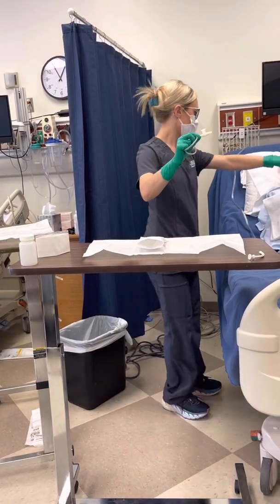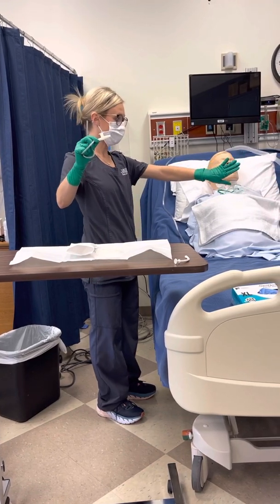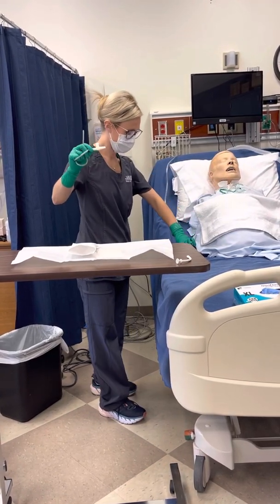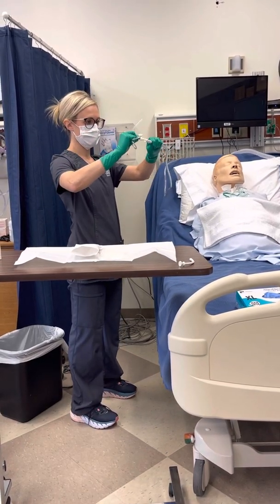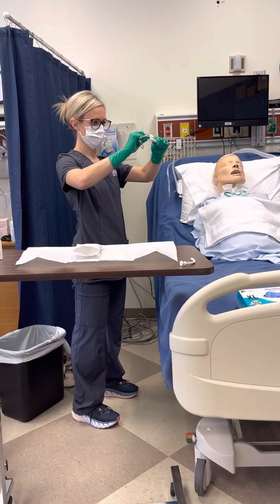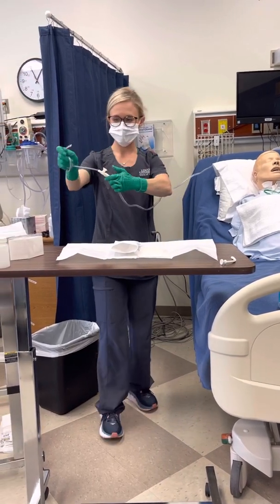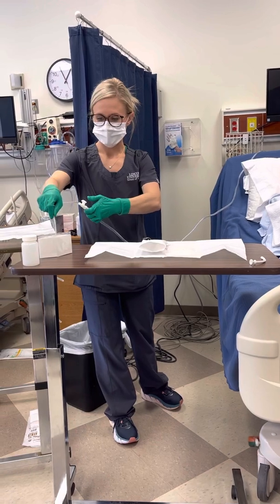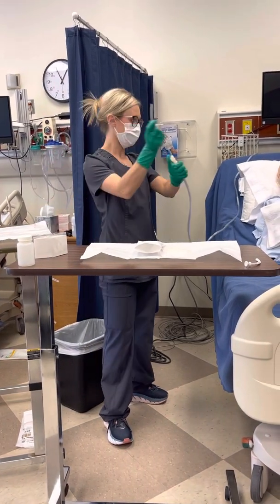Okay, I'm going to remove the oxygen. As I said earlier, my patient is hyperoxygenated. I'm going to pick this up. This hand has now become dirty. Then I'm going to test to make sure that I cleanse my suction before beginning.